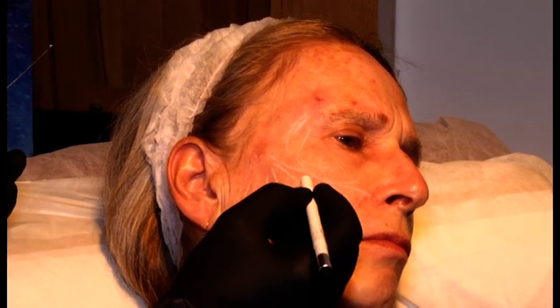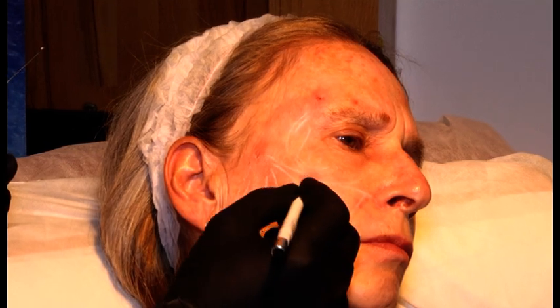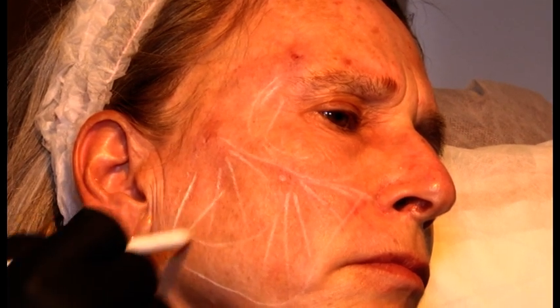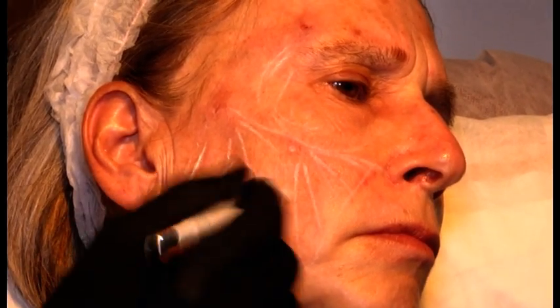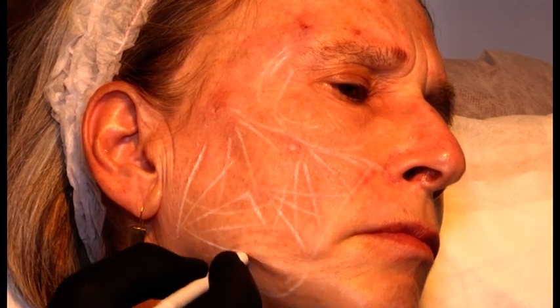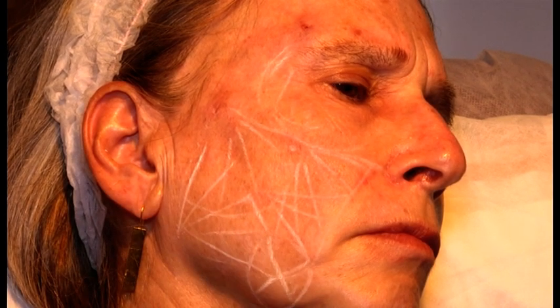So I've injected 0.5. 0.5 here. All right? Now, here I will have another entry point. And I inject here. Here I will have another entry point, and I will inject here. And here I will have another entry point. I will inject here. And I will stay away from the jowl.